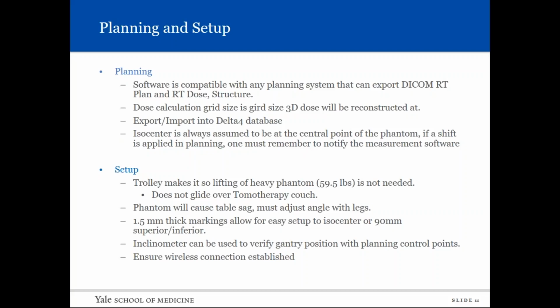After that, you're pretty much ready to go. Planning is simple. You create it like you create any verification plan. You're just taking the delivered dose and projecting it onto something that's different than the patient's body. The software is compatible with any planning systems that can export DICOM RT plans and RT doses and RT structures. The structure is not a necessity, but it's a nice added feature that the software does provide.